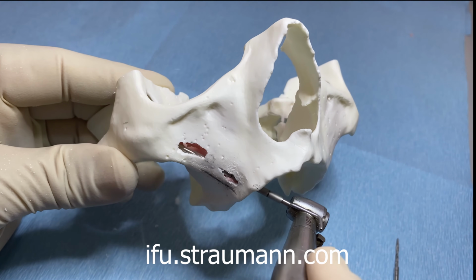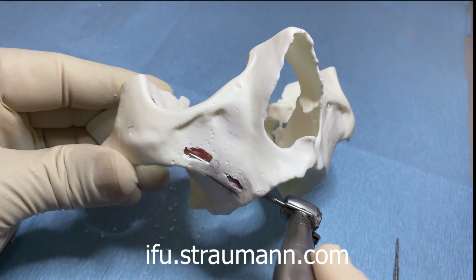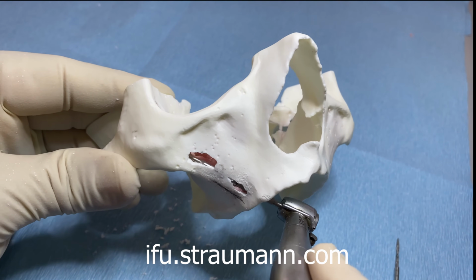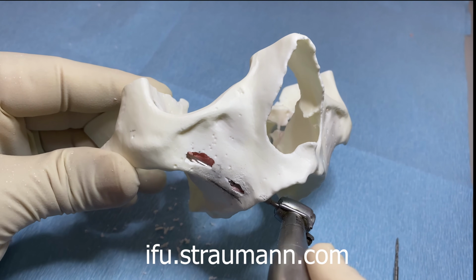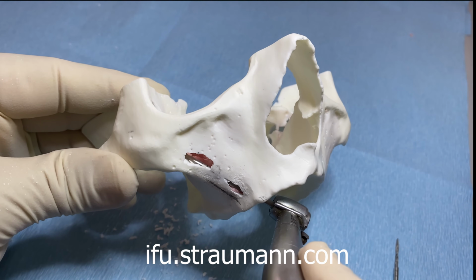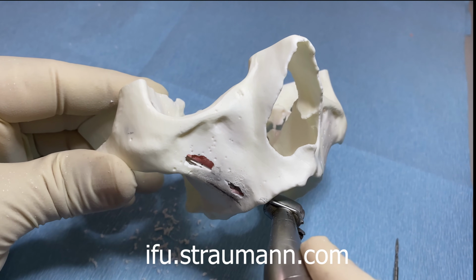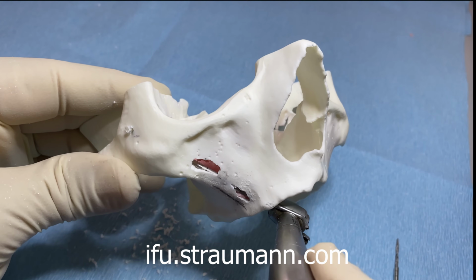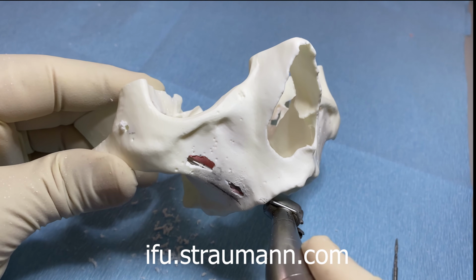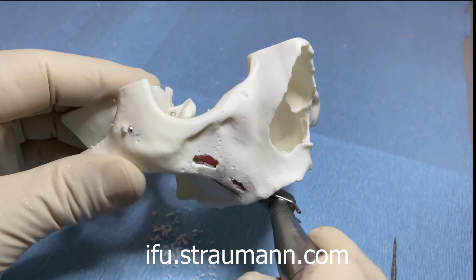And I will go ahead and now drill, making sure my drill stays against my lateral sinus opening wall, and just pump gently back and forth, until I'm feeling my osteotomy comes through the lateral cortex of the zygoma bone.